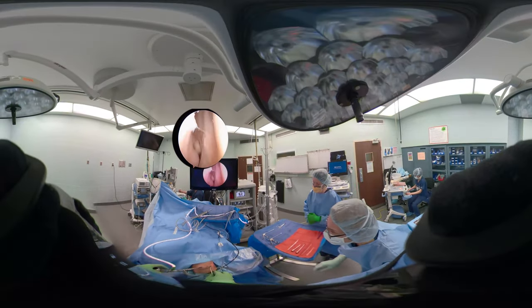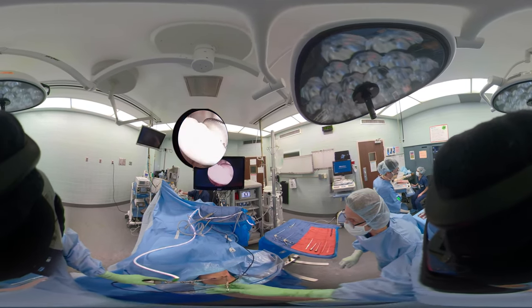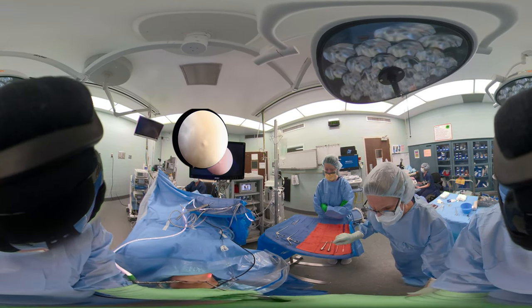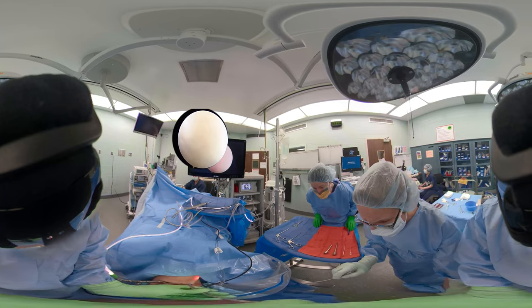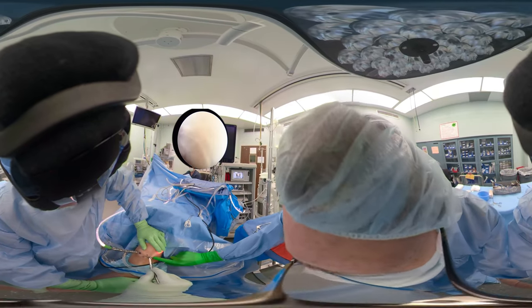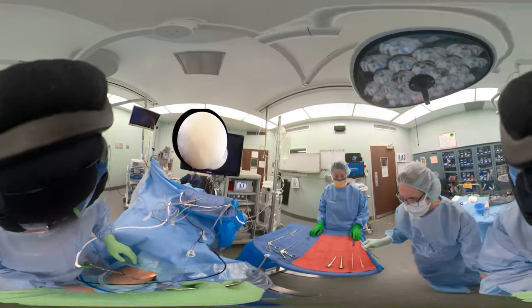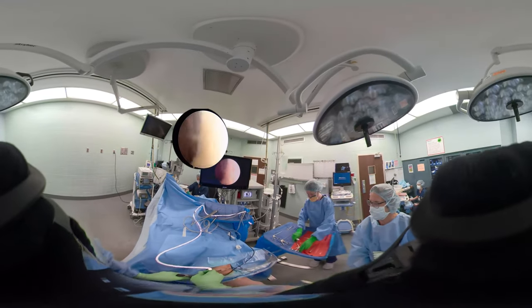There are no ratchets on this grasper. We open the jaw as wide as possible. Make sure we have a good bite on that loose body — if we don't have the best bite, sometimes we can park it in the notch and use that as a backboard to grab it a little better. Now have somebody hold your scope and see how he's grasping the Schlesinger very tight. We're in the lateral gutter. I'm going to make a small increase in the incision to get that loose body out. He's pulling, making a slightly bigger mini arthrotomy — and out comes the loose body. Didn't lose it in the soft tissue. Loose body removed.